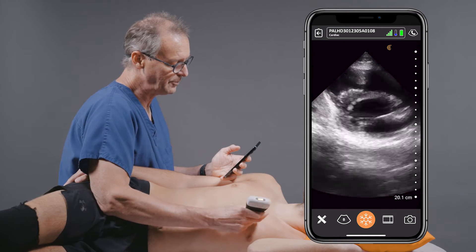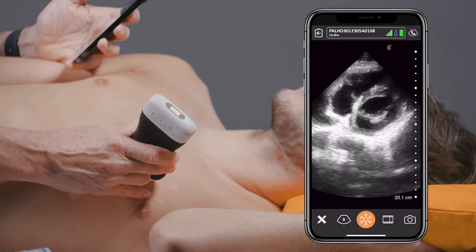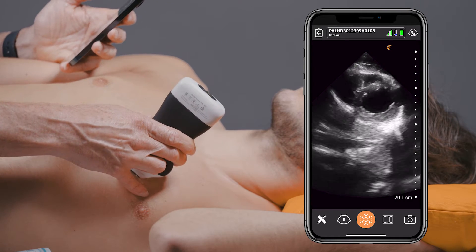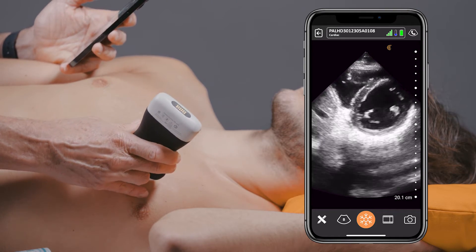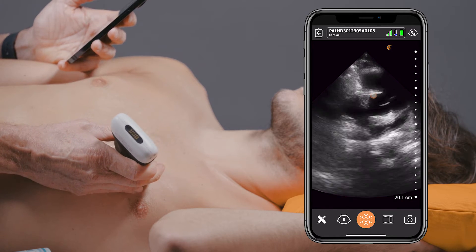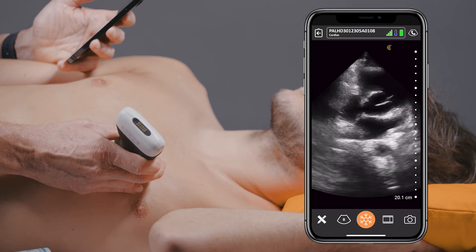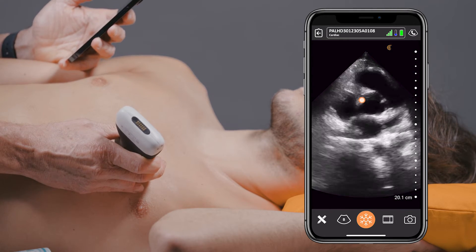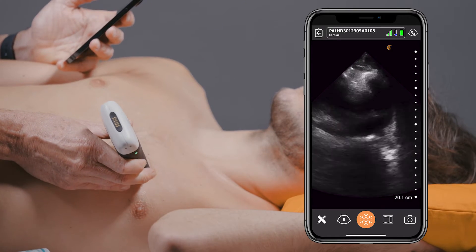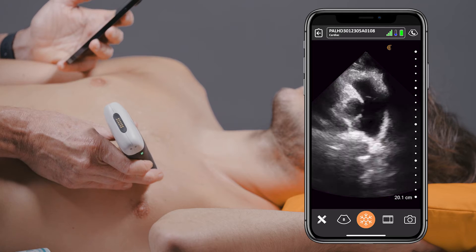From here we can flip over into the parasternal short axis view. By angling the probe towards the apex, we can see the apex of the heart. We can also angle the transducer to pick up the base of the heart, specifically the aortic valve. To the left of the aortic valve you see the tricuspid valve, and by continuing to angle the transducer, we can even pick up the pulmonary artery and the pulmonic valve.